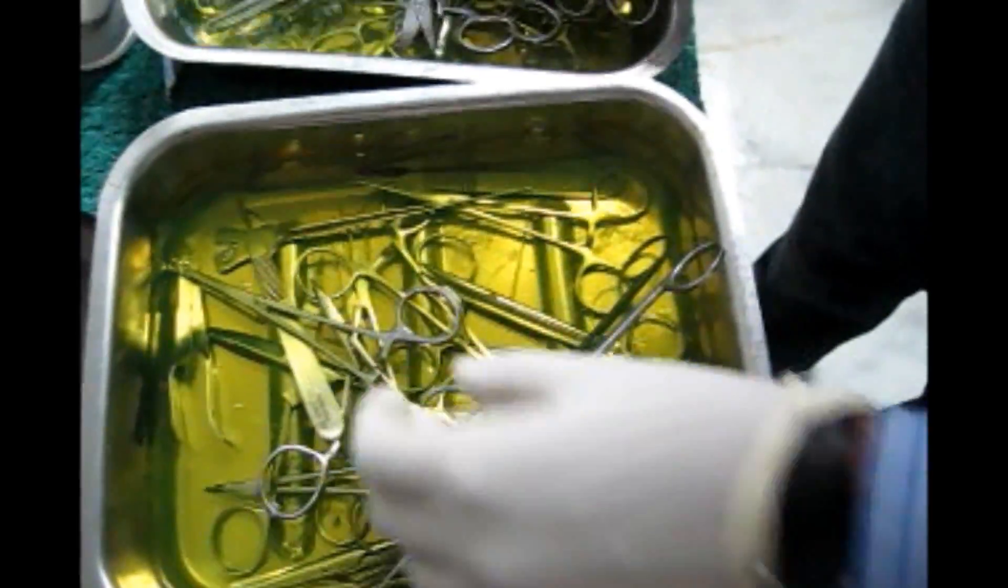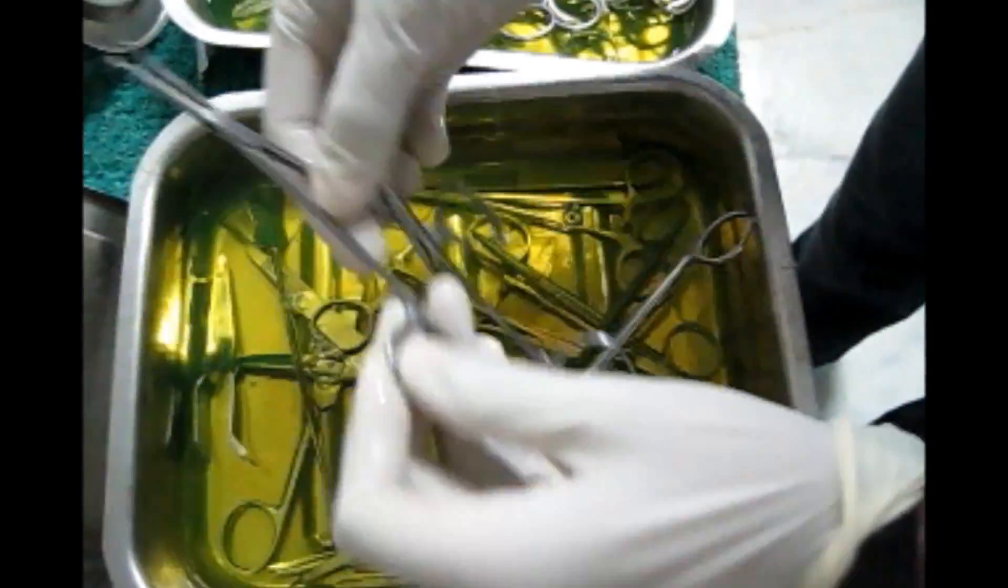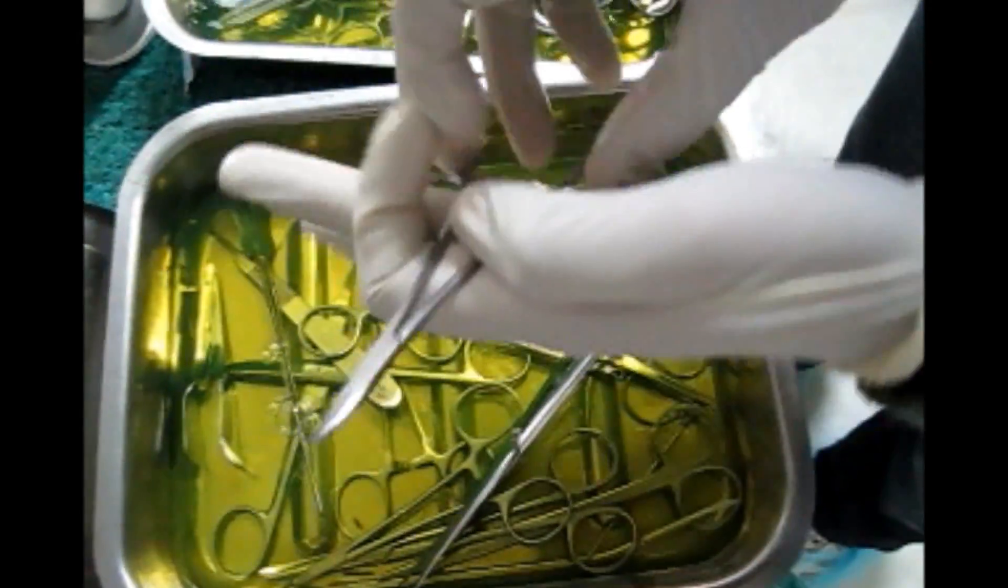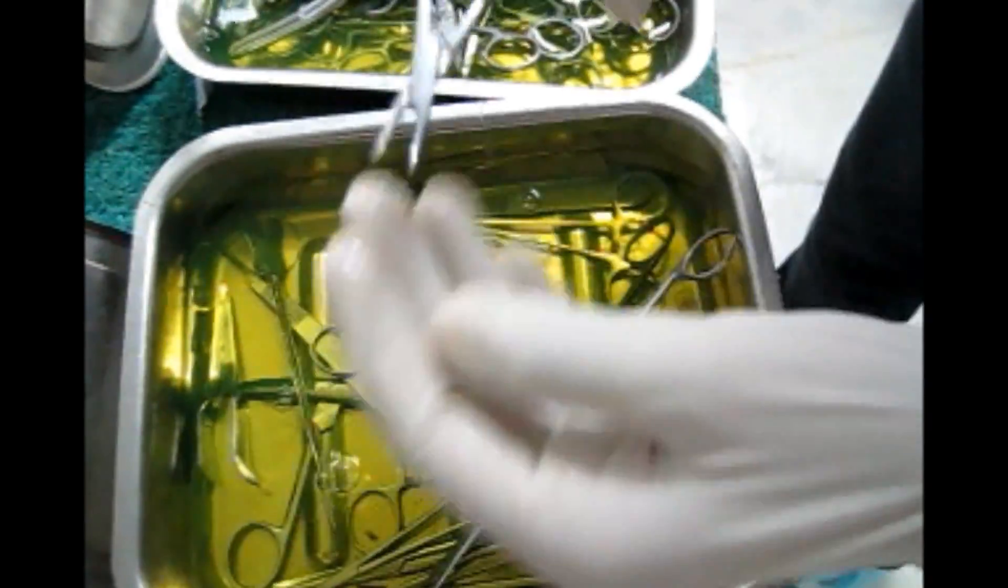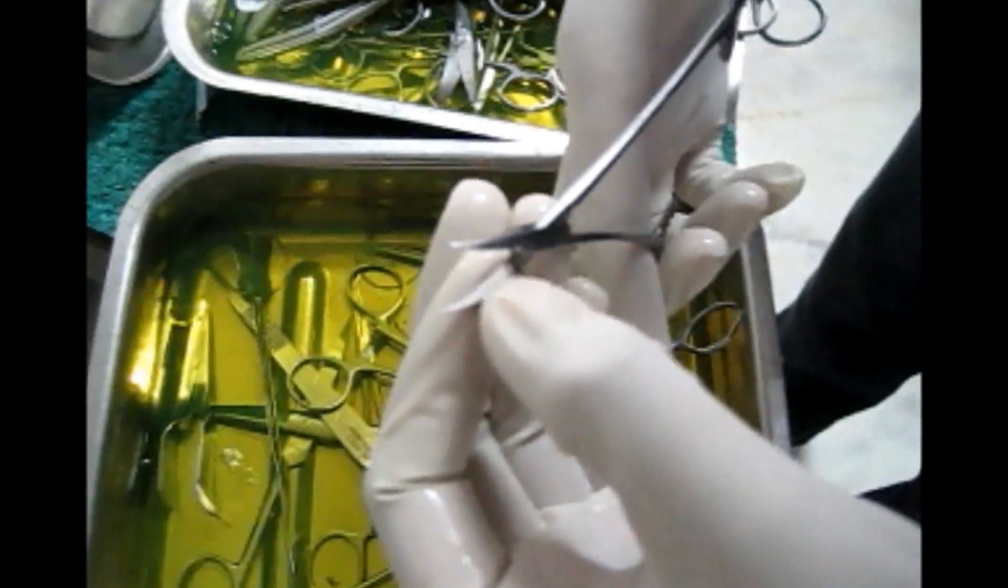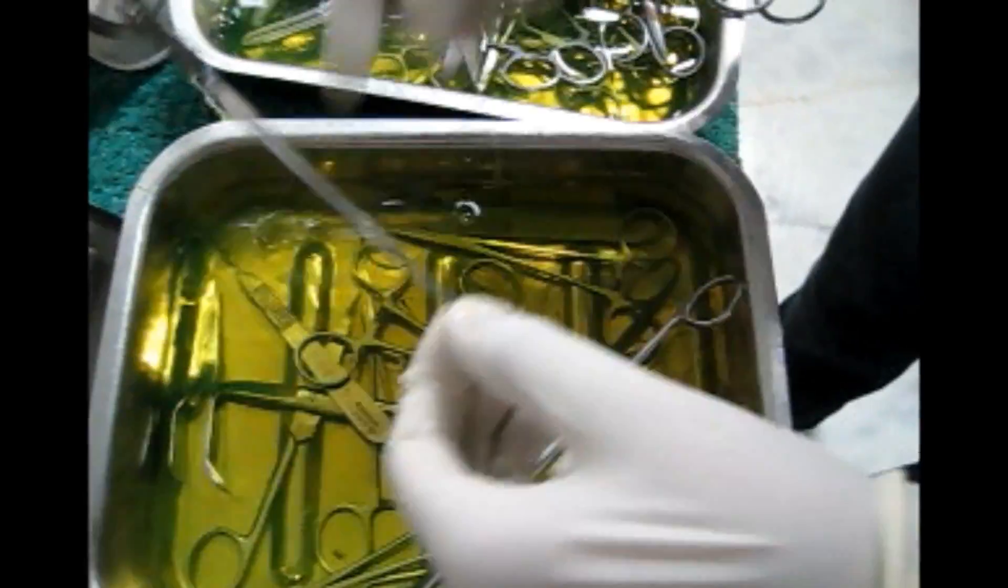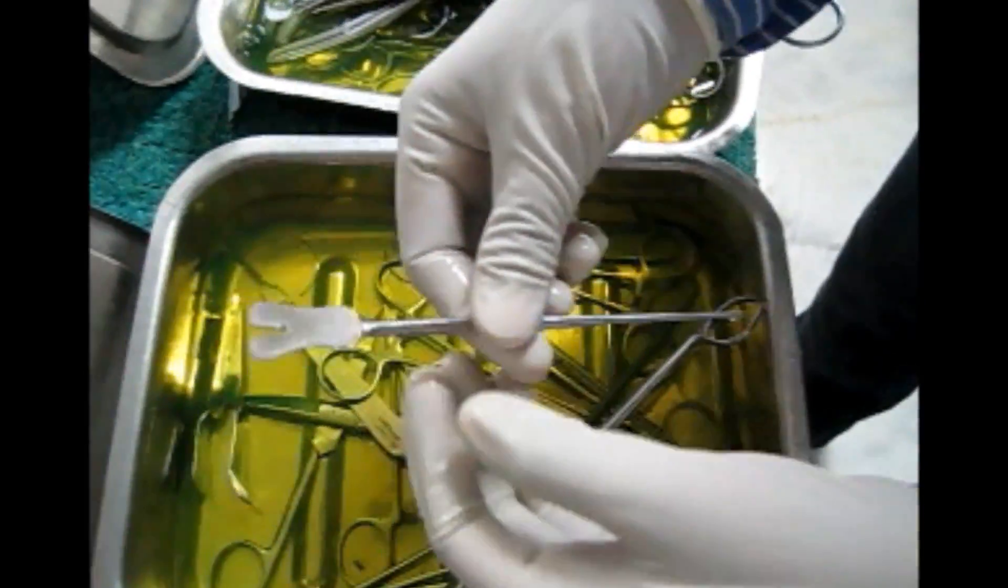This is the bone cutter. This is another ring forcep. Another one, and this is the plain mosquito. You can see there are no dentations.